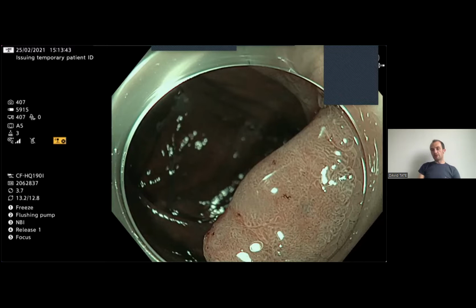It probably means it's not a serrated polyp, I would say, because with serrated polyps, and we'll come to a few examples of those in a minute, the edges tend not to be well demarcated. But indeed, for most other polyps, the edges are pretty well demarcated. It's mainly within the polyp that you're looking for something else that's demarcated, a bit like the edges, and then that should draw some concern.